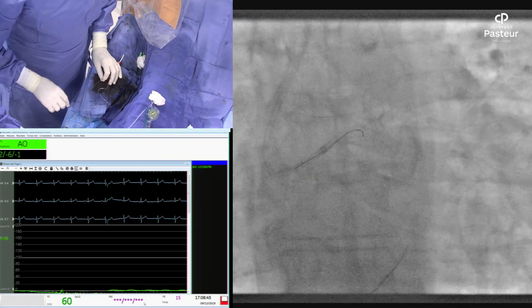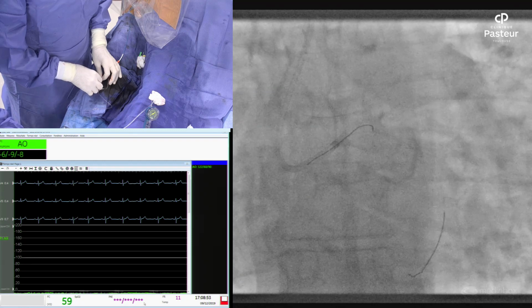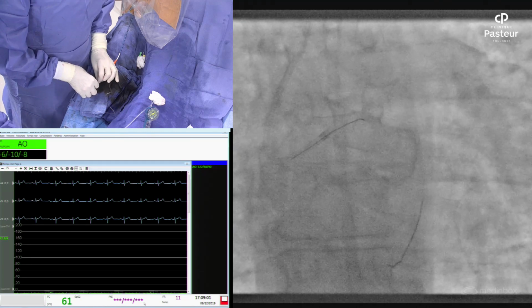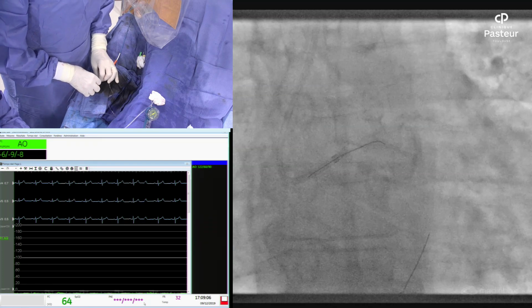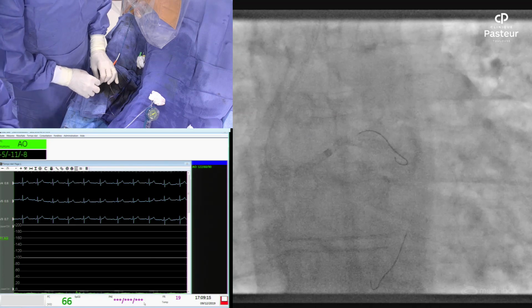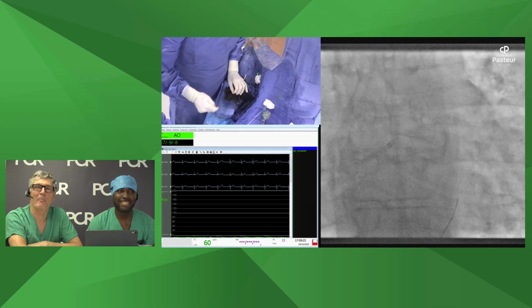Oops, I remove the wire. You can remove this one, I think, because it's already stented. Sorry for this mistake, you see. We try to place it, but the system of question is not working. So it's only your question. Yeah, absolutely. So Adam, we are waiting for all your question. So I will remove it.